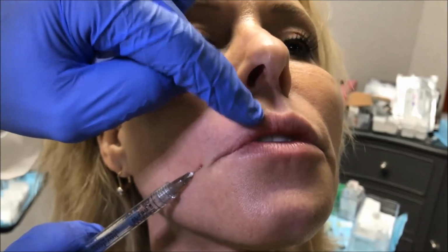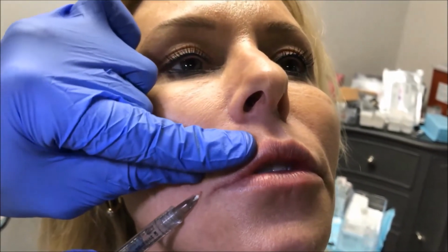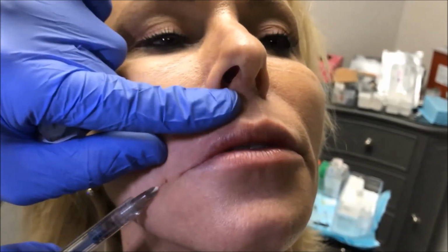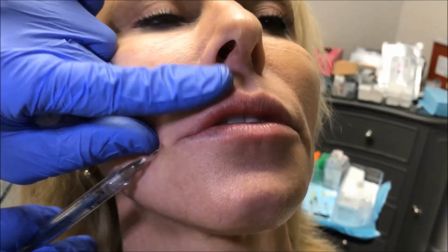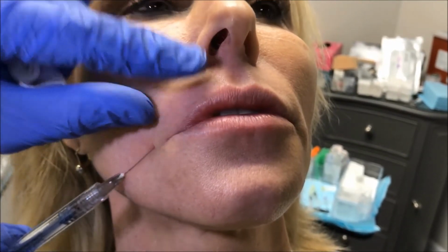Well, I'm not quite there. Here's the tip of my cannula. I want to get here to the Cupid's bow. Now I'm there. Now I'm going to come back and I'm going to do that same submucosal shading technique for the upper lip. Again, you can see my cannula. Good.